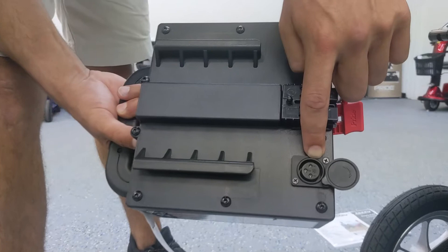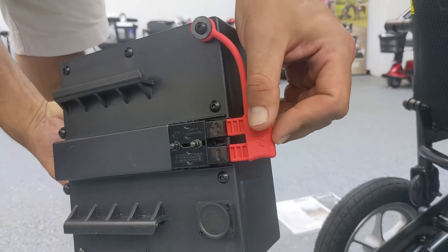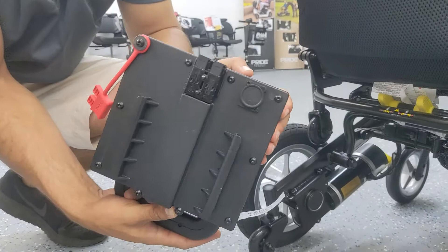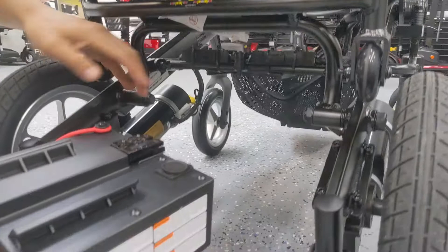The battery has an XLR charging port like most power wheelchairs and mobility scooters. You just stick the charger in there and the other end plugs into your household electrical outlet. If you are going to store the battery for a while, keep it charged. Best practice is to keep it fully charged and top it off about once a month.